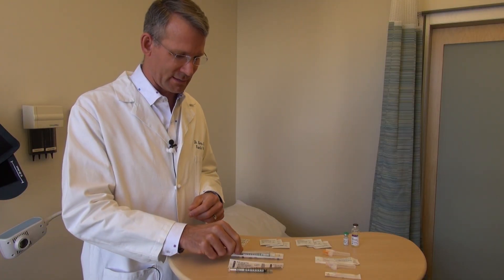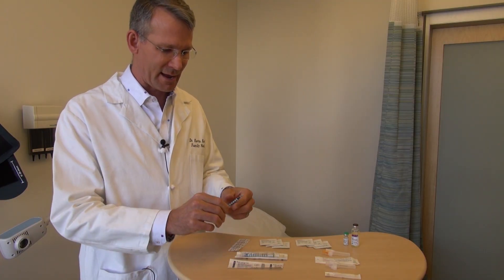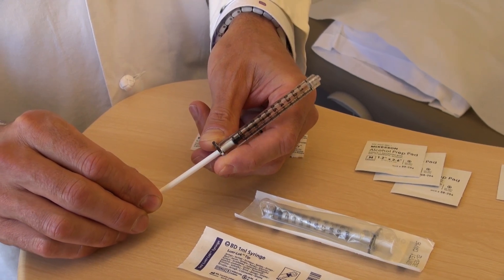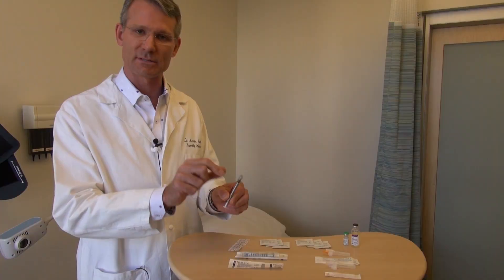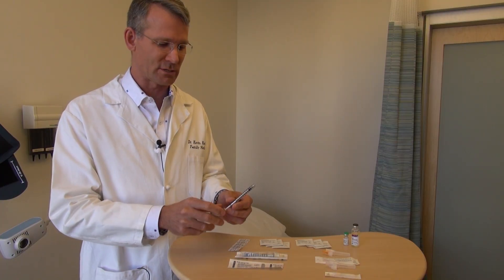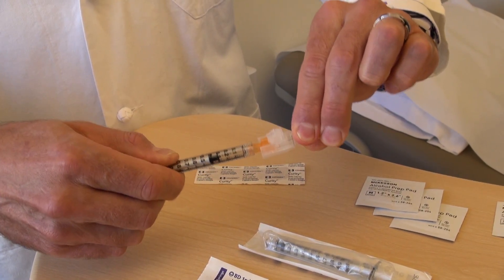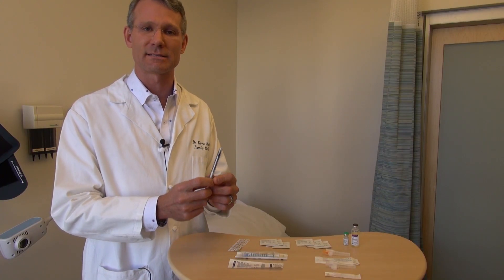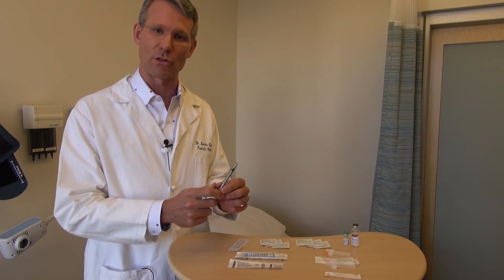Next we've got the syringe. The syringes I specify for my patients are typically one milliliter syringes just like this one, and they have a threaded top, which is incredibly important. We want the needles to thread onto the end of the syringe so that when you're doing the injection the needle doesn't pop off. If your pharmacist tries to give you a syringe without the threaded end, politely decline and insist on the kind your doctor has ordered.